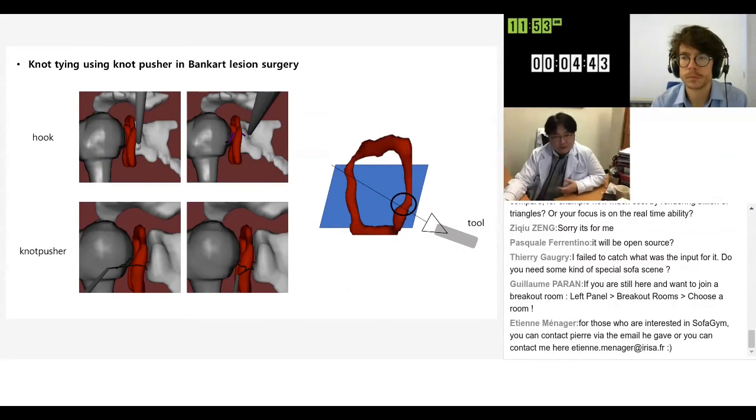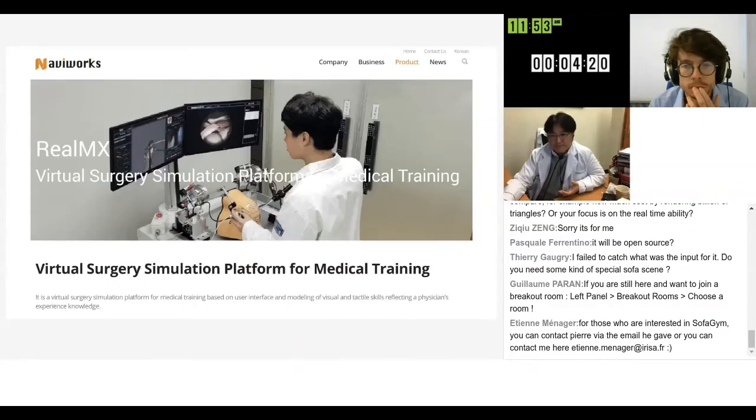Actually, I do have video clips in Vimeo, but I'll skip the presentation for now. Another scenario was to implement usual moving and manipulation with thread-like structures for knot tying and knot manipulation simulation.